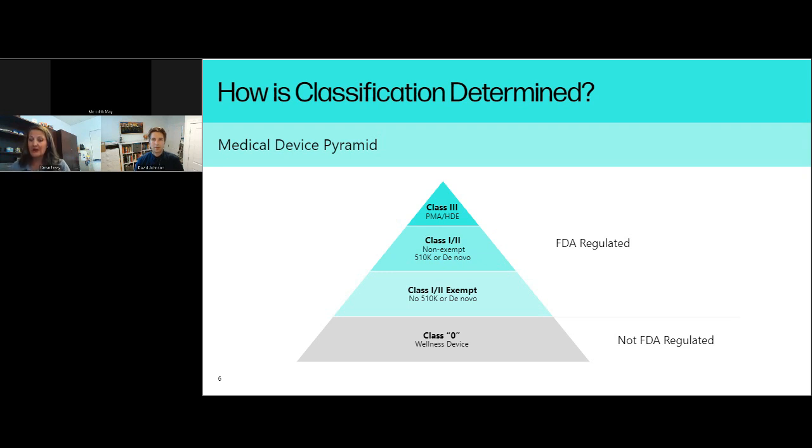So we're trying to eliminate all the variables and correctly characterize the device. The other thing that comes out with additive manufactured devices is that they are patient specific. That's different than a special and a custom. We're looking at geometries that have a volume and shape that is patient specific. So now, instead of looking at what the worst case size is and just testing that, companies have to decide, and we work with our clients on this, what is the minimum footprint and minimum volume, and basically you're now characterizing the corners of the sphere that the patient-specific device can be printed in and making sure that that's safe.